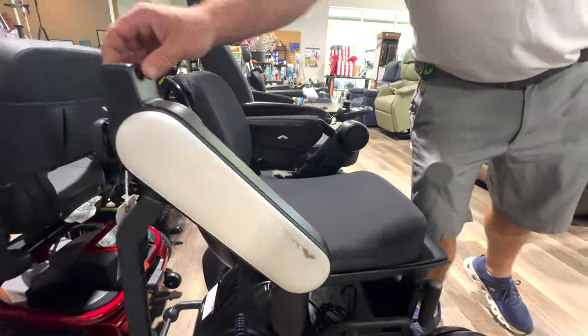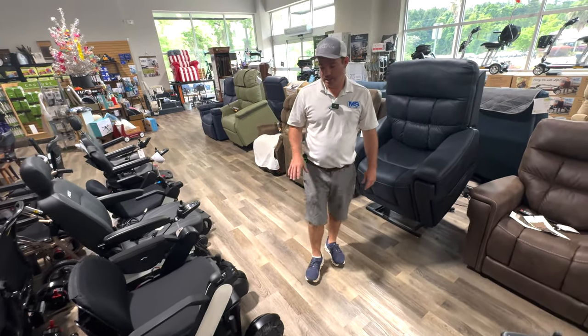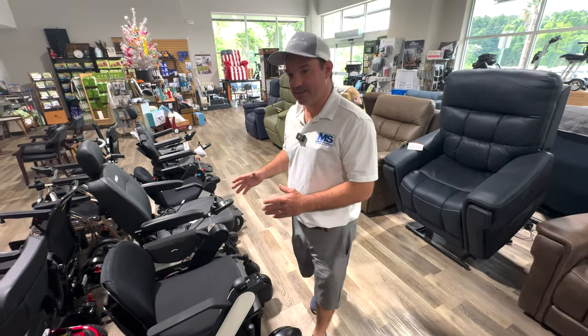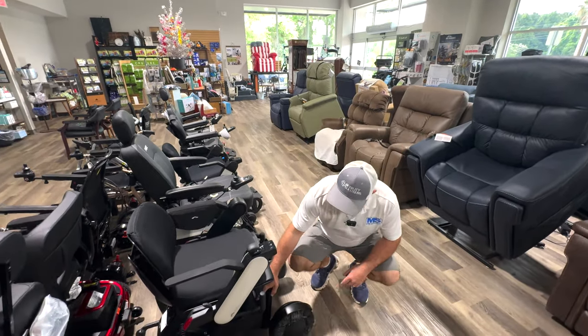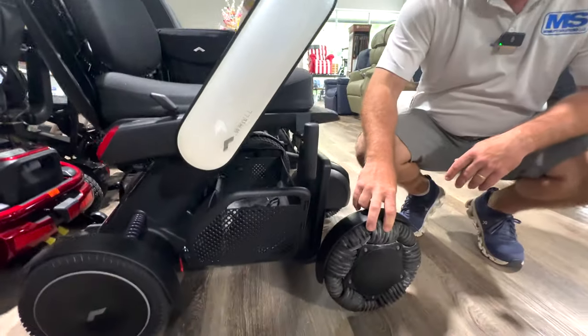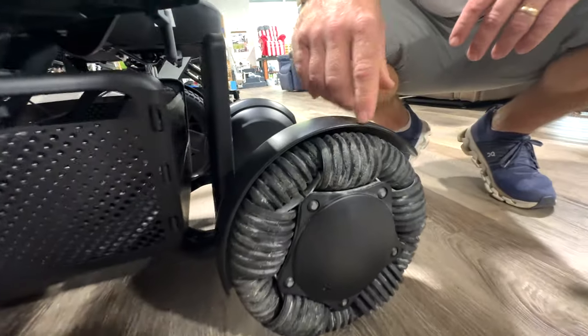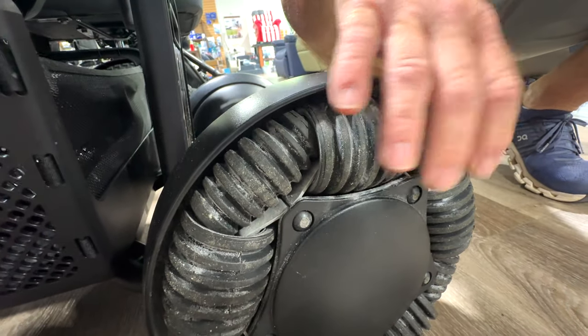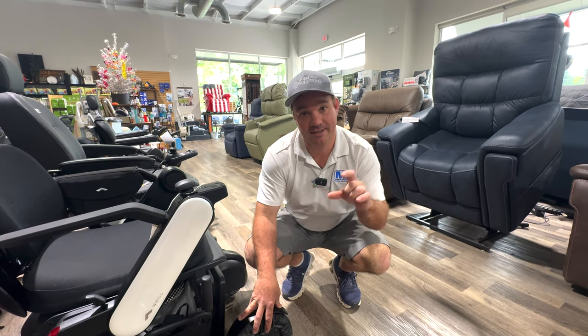It also has three modes with four different speeds in those modes. It can be disassembled. It comes in a 16, 18, and 20 inch seat. There's a basket underneath it. The sell point is the omni wheels — these wheels make this thing turn extremely sharp. This will also climb a two inch curb, so if you have most thresholds or a two inch rise somewhere you go, this can climb if you're going straight at it.